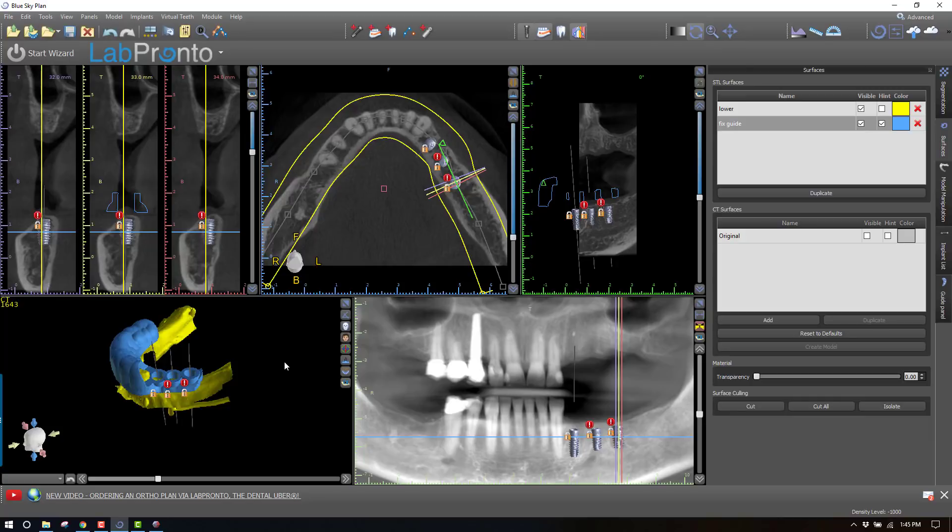Hey, this is Dr. Corey Glenn, and I wanted to show you in this video how to go about making a combination bone and tooth or soft tissue supportive guide.